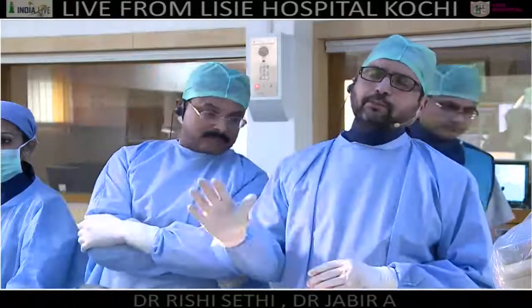So our plan clearly is that, given the size of this OM, we had discussed previously, I think it's a live case, we probably end up not stenting anything, but the fact is we should be making the right decisions for the patients. The point is that this huge OM, the plaque of the circumflex is coming right up to its ostium. Doing this particular circumflex and compromising this OM would be a little more challenging process, which we will take that decision later on.